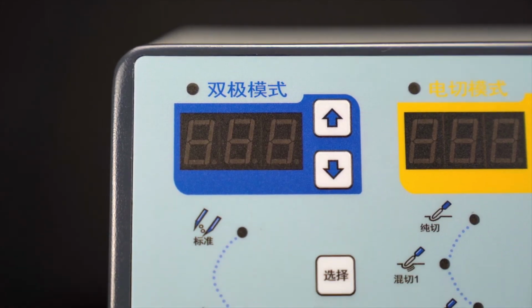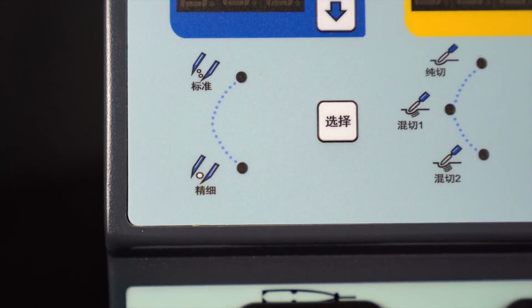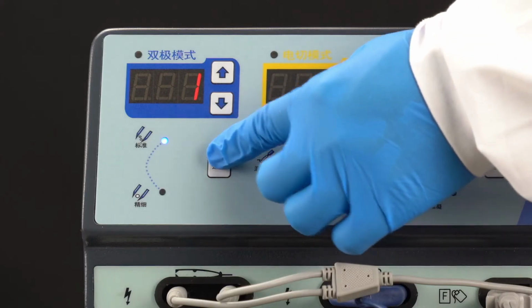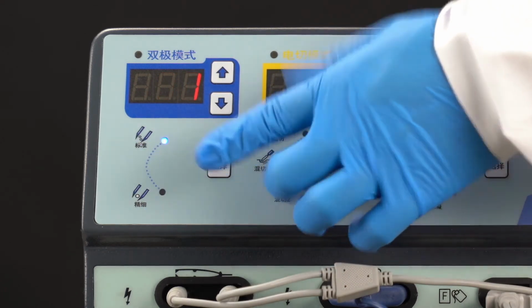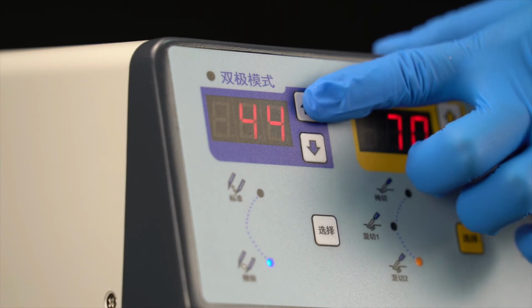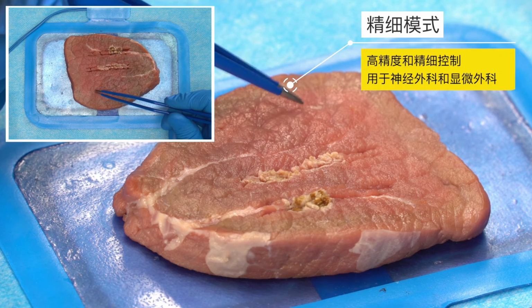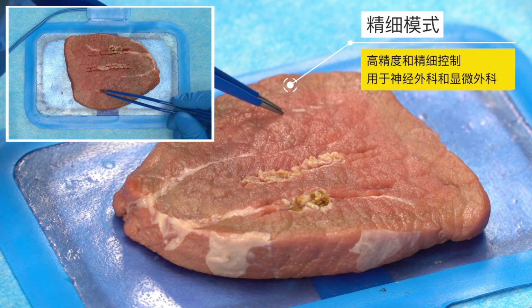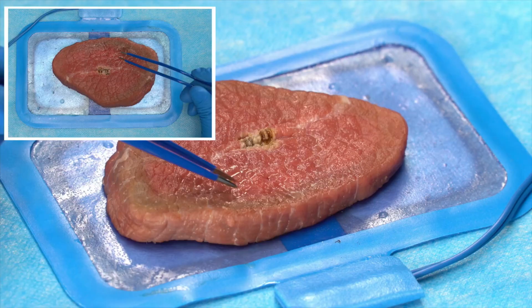In bipolar mode, ES-200PK electrosurgical unit has 2 modes: standard and precise mode. Similarly, we push buttons to switch the bipolar mode and set the power. Precise mode is used for high precision and fine control of the amount of drying. Used in neurosurgery and microsurgery.